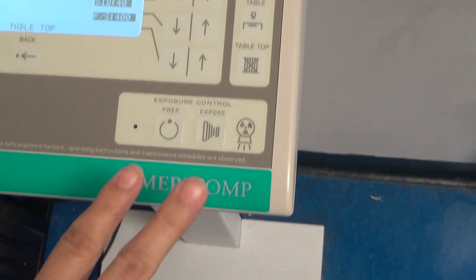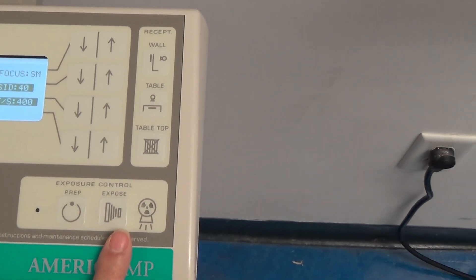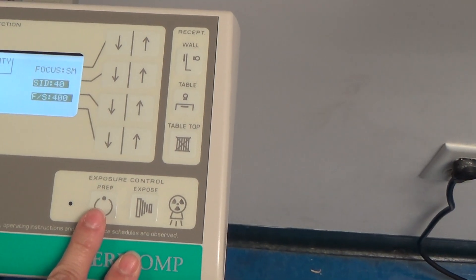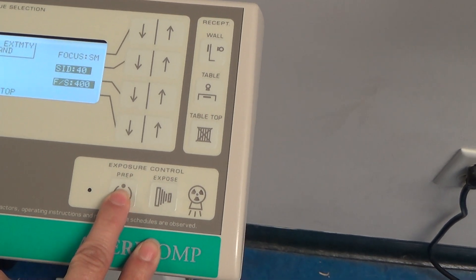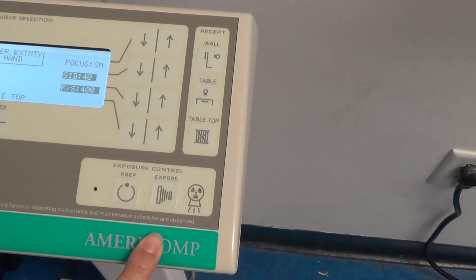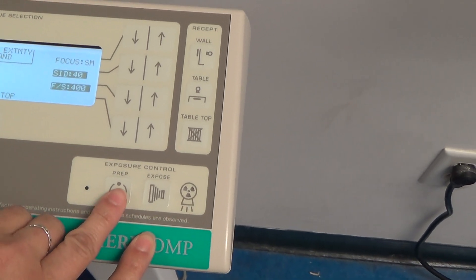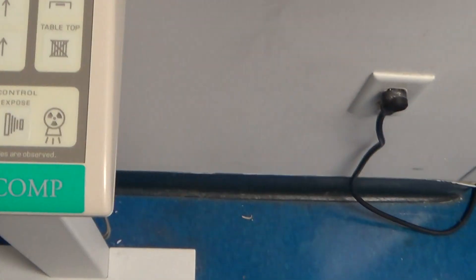Now, over here on this side, this is actually your exposure control. This has actually got two separate buttons unlike the other one. So this first button you're going to be pushing in — it's got a light on it. This one's going to warm up that rotor and get that anode moving so that we can create those x-rays. And then when that's warmed up and ready to go, we'll hit the exposure button, and we keep our fingers on both.